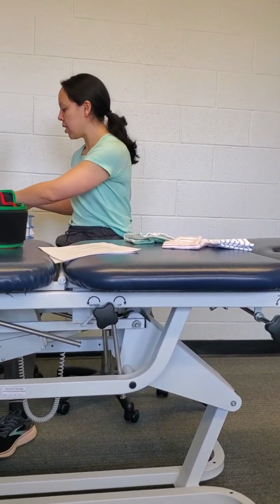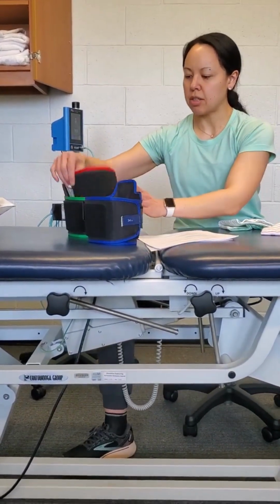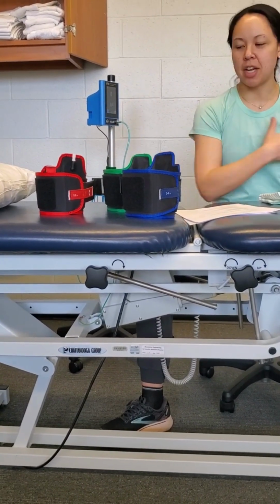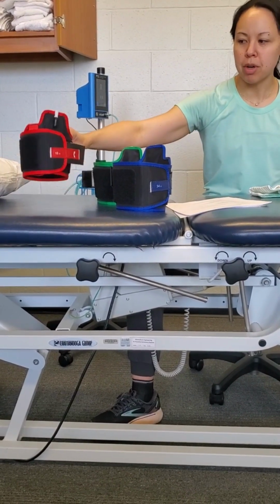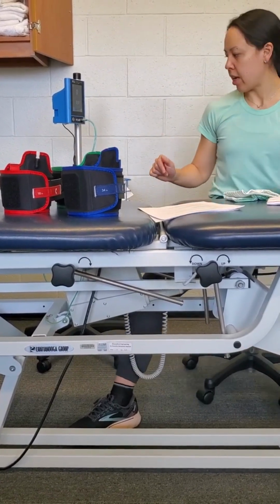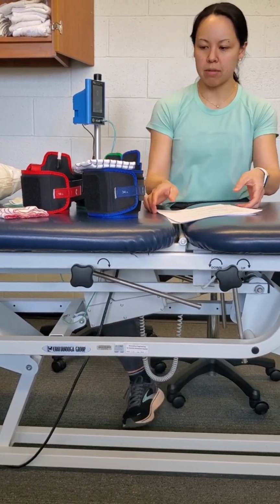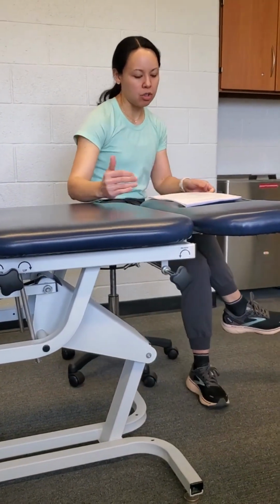So I guess we'll just start with the machine a little bit. These are the three different cuff sizes. For the most part, you're going to be using the red one for upper extremity unless the patient is a really big person and has a lot of muscle mass, then you might have to go to blue. But for the most part red is going to be upper, and blue and green are going to be lower, and we'll go over how to place those. And these are the three sleeves, obviously color coded, that go with the corresponding cuffs.